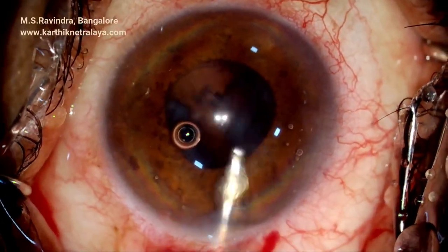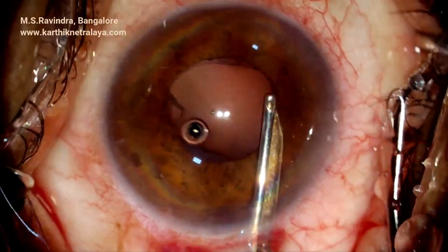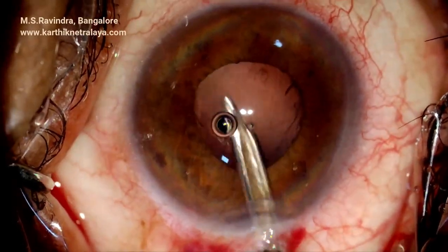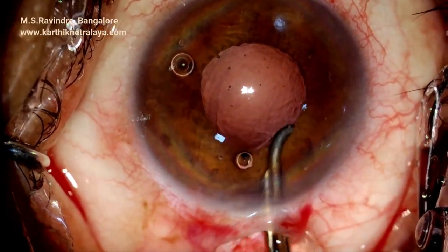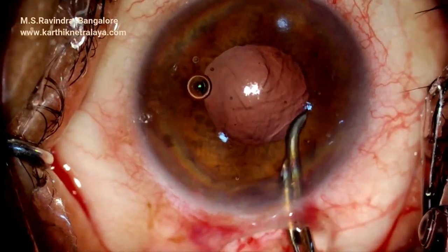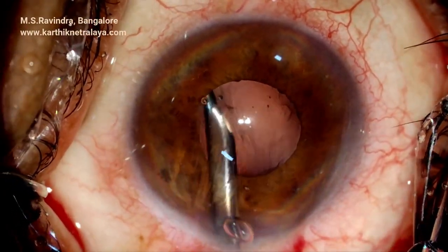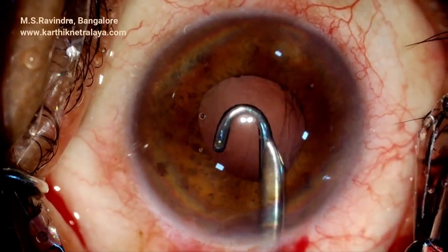Protection is against the moving nuclear hemi-piece. Cortical aspiration is done systematically. As you cannot see the peripheral lodging of cortical chunks right and left, the Simcoe cannula is used to aspirate the leftover cortex. Some amount of loose cortex will be present all around.